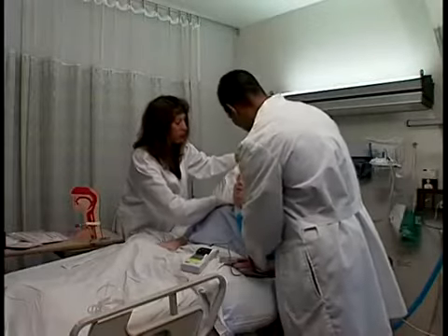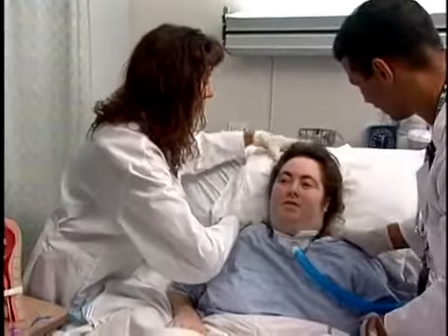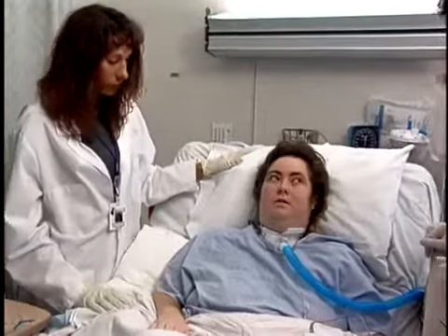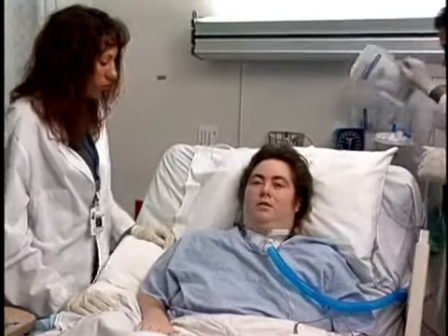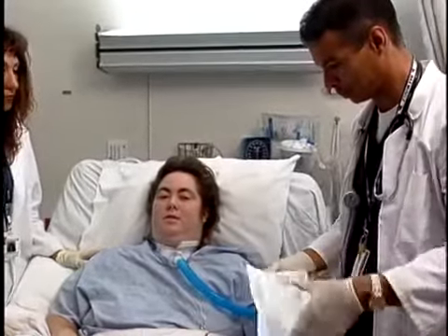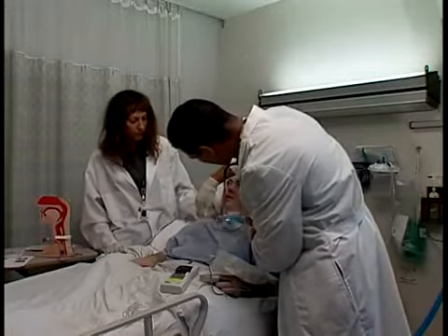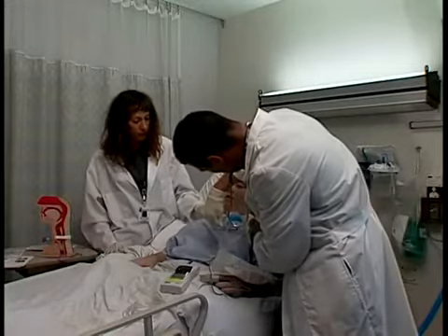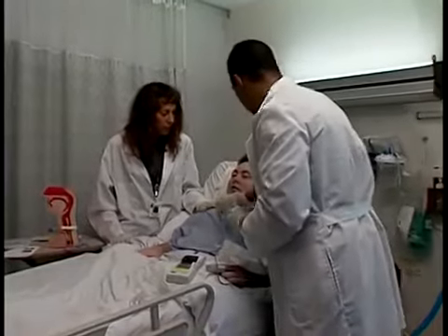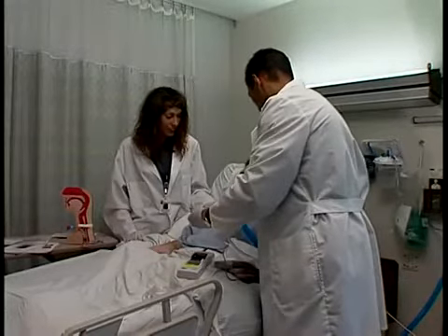The patient should be positioned comfortably, usually at a 45-degree angle or sitting position, to facilitate diaphragmatic movement and maintenance of a patent airway. The tracheostomy tube should be correctly aligned in the trachea to maintain a patent airway and patient comfort. Suction is needed prior to placement. Secretion accumulation in the oropharynx may require tracheal and oral suctioning before deflating the cuff. For infants and small children, especially obligate nose breathers, you may need to suction nasally.